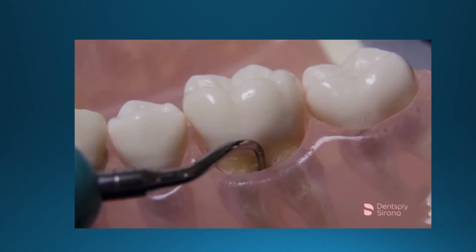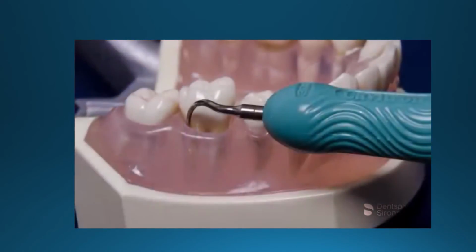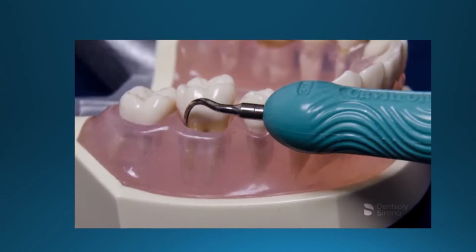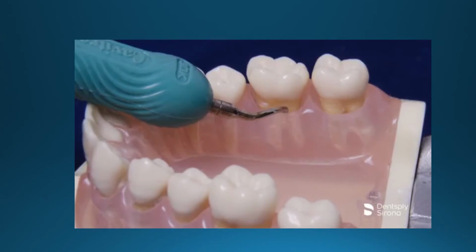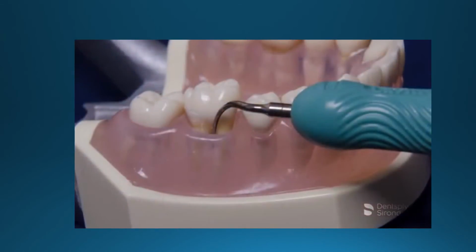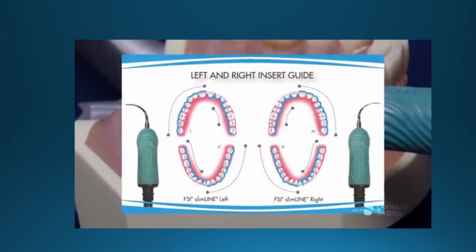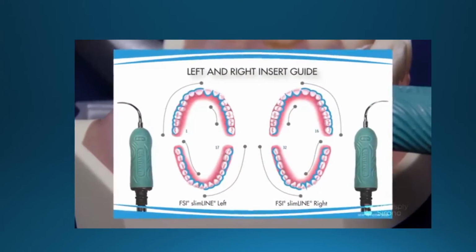When access is indicated in deeper pockets, in particular the posterior teeth, a curved insert is often necessary to maintain true adaptation of the terminal 2 to 3 millimeters at all times. A review of dental anatomy is recommended so the clinician is familiar with the topography of the different molars and the corresponding concavities and convexities. Understanding the area-specific design of these inserts is essential for proper adaptation.